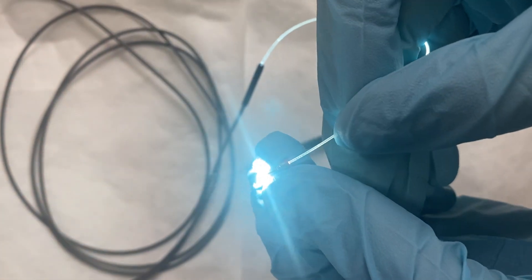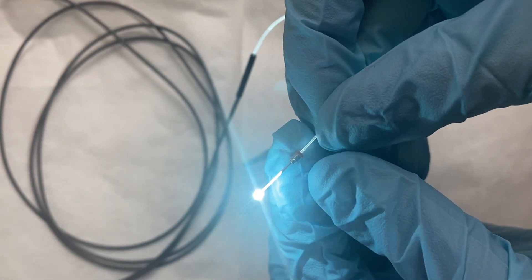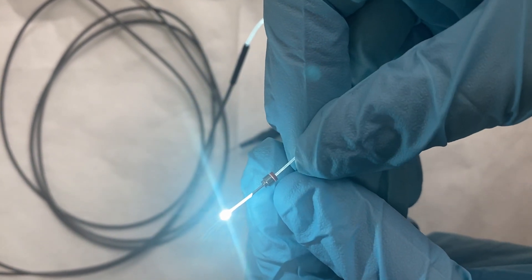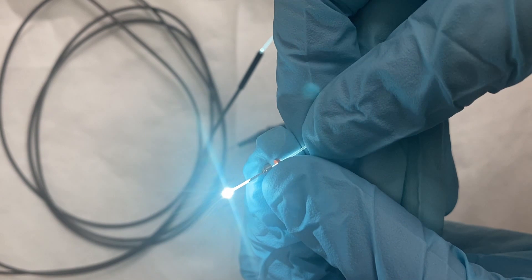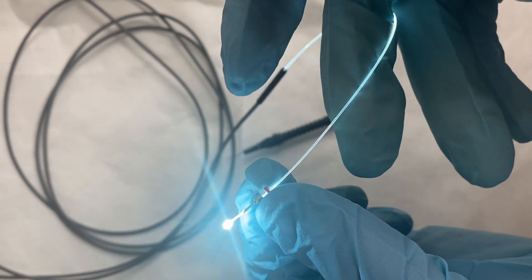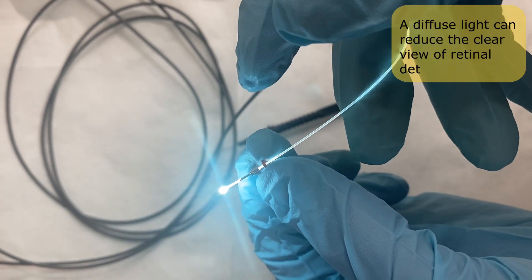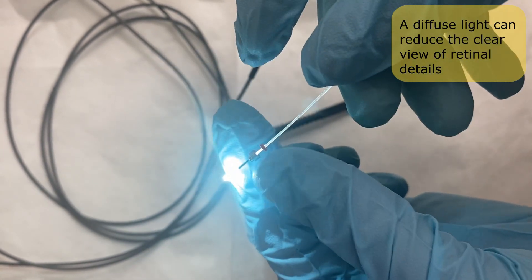Most chandelier probes require an additional sclerotomy for inserting the fiber tip. However, some models can still be placed into regular scleral cannulas. The disadvantage of a chandelier during peripheral shave is that diffuse light can reduce the clear view of retinal details.